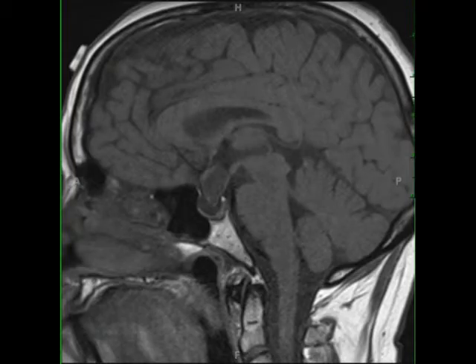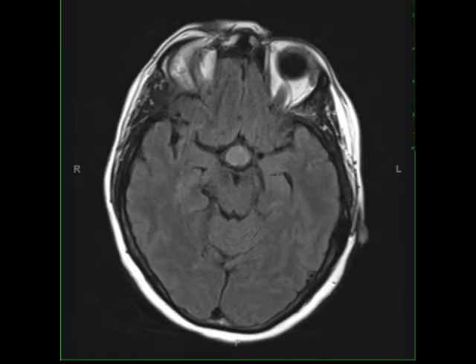This is a 12-year-old male with chronic headaches and new-onset diabetes insipidus. Arising from the anterior surface of the infundibulum, there is a circumscribed, centrally cystic lesion. On the sagittal T1-weighted images, the central cystic component demonstrates signal intensity slightly greater than the surrounding CSF space.